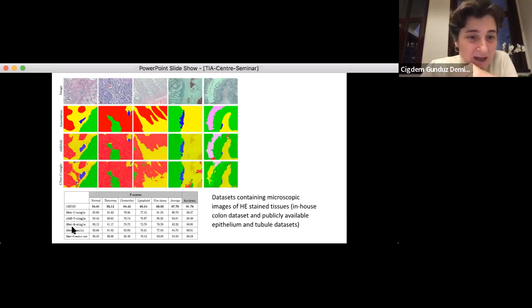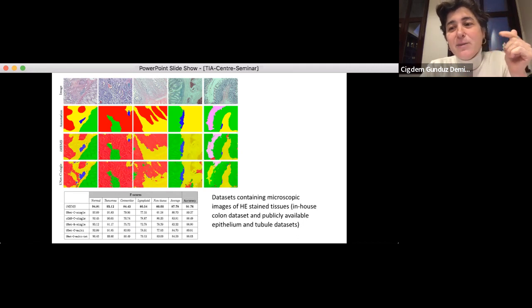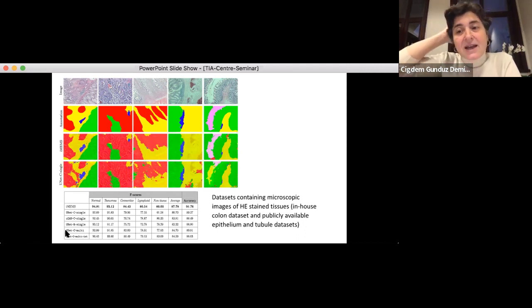I don't remember the exact details, but in one approach, we use a multitask design where we estimate the segmentation map as one of the tasks, and we are reconstructing the image as the second task. So it is such a multitask architecture, and in that case, it may help.